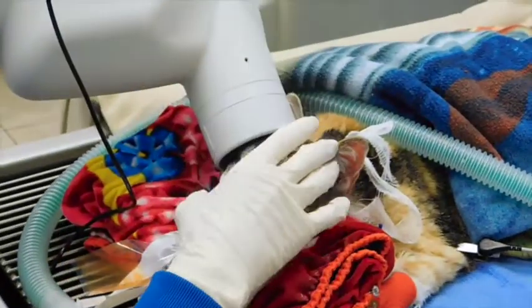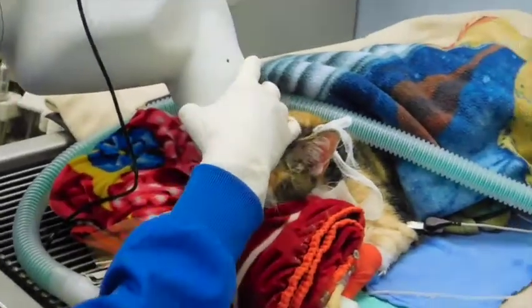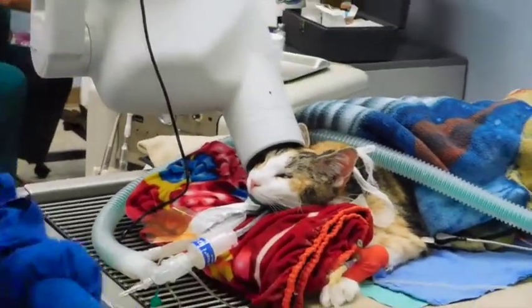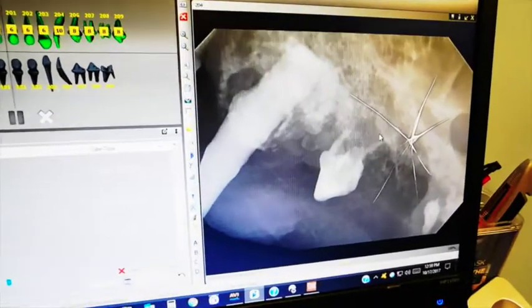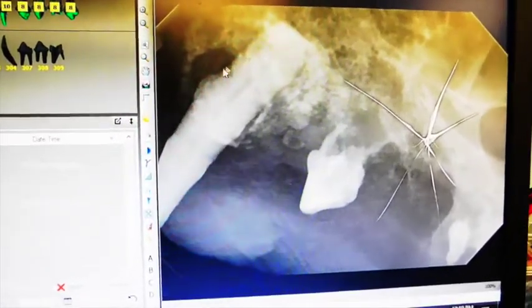Now we start the procedure with radiographs, with a digital x-ray. We are carefully positioning the sensor and we're going to shoot. On this enlarged digital radiograph, we can clearly see the canine, the 204.